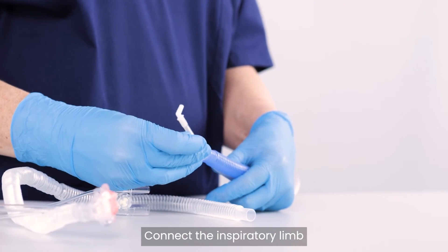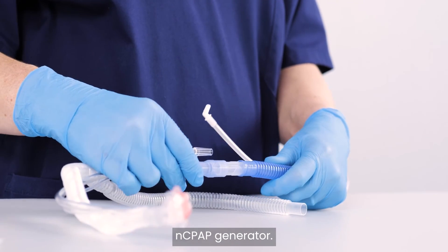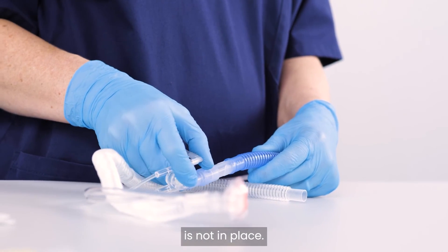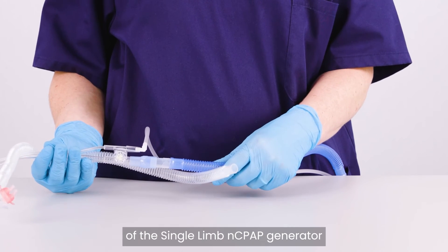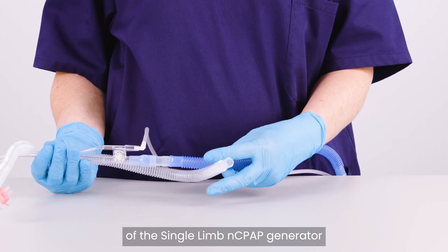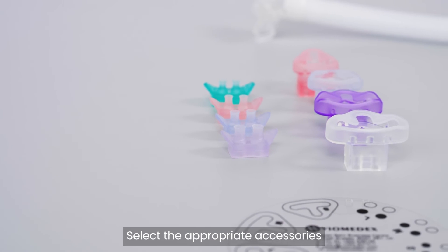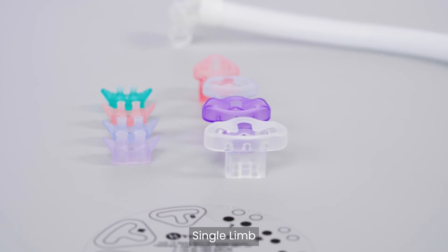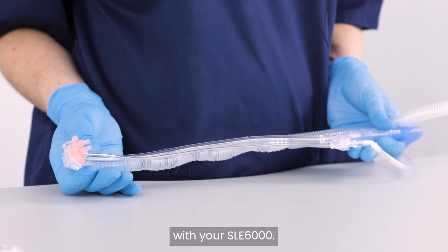Connect the inspiratory limb to the inspiratory connector of the single-limb NCPAP generator. Make sure that the yellow restrictor is not in place. Connect the proximal airway tube to the proximal sensor connector of the single-limb NCPAP generator or first-breath generator. Select the appropriate accessories for your patient and you are ready to use single-limb non-invasive ventilation with your SLE-6000.